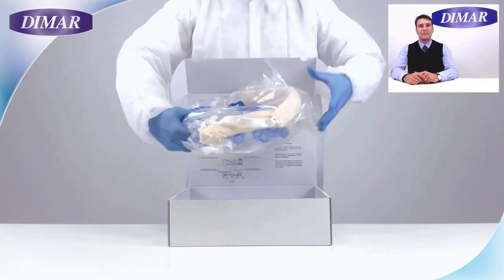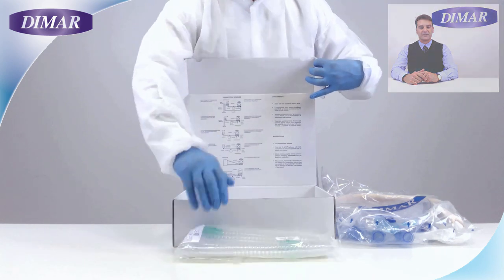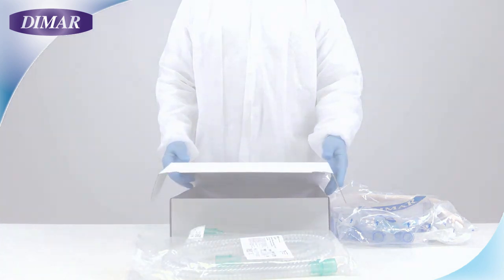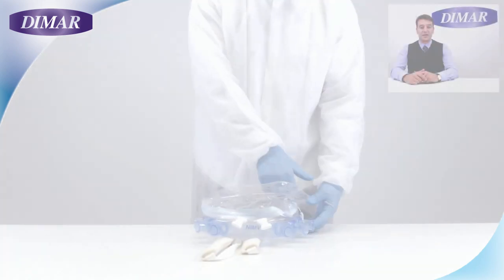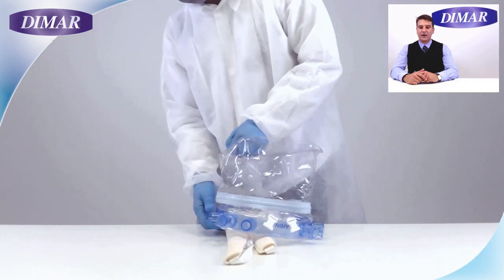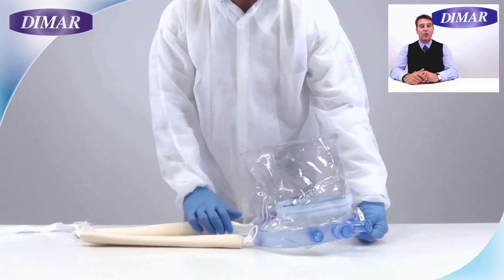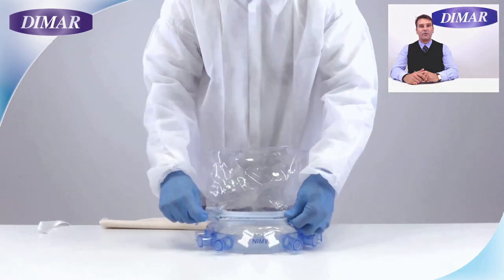Inside the helmet box you will find the helmet and two smoothbore circuits. Check the content and unfold the helmet, opening it up to its cylindrical shape. Check the connectors and the fixation ring for the armpit belts. Open and close the zip twice to check the functionality, and leave it open.